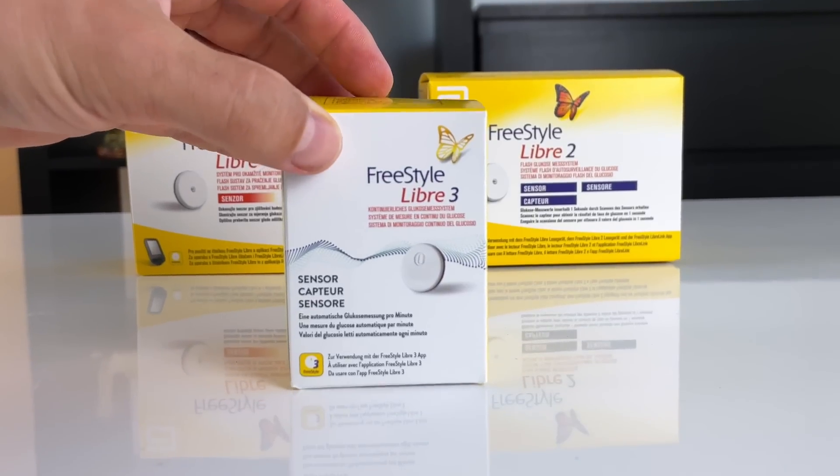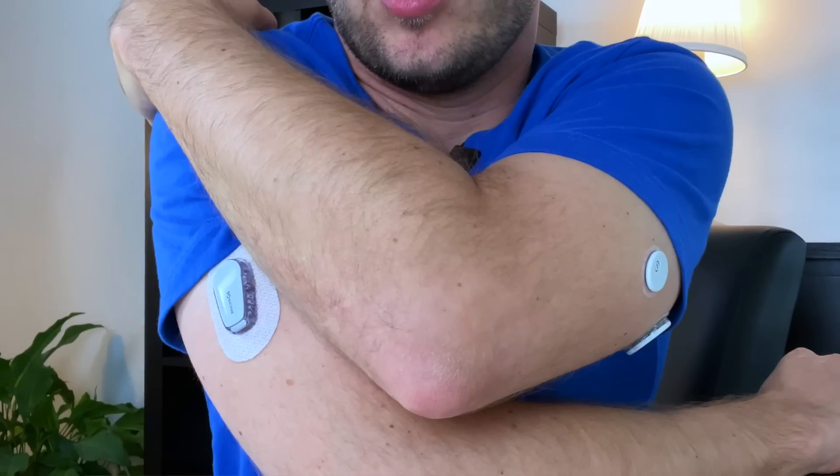If you are deciding between Freestyle Libre and Dexcom continuous glucose monitors, don't click away because this video will help you find out which of these two systems you should get. I will share some information that I never shared before.